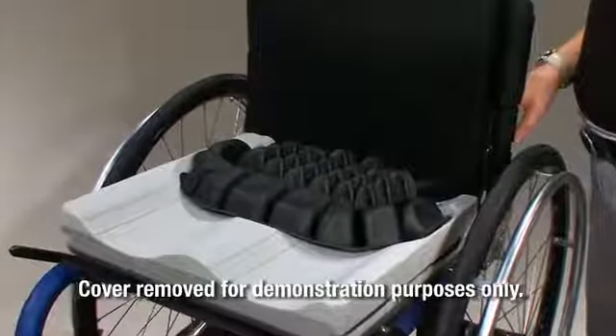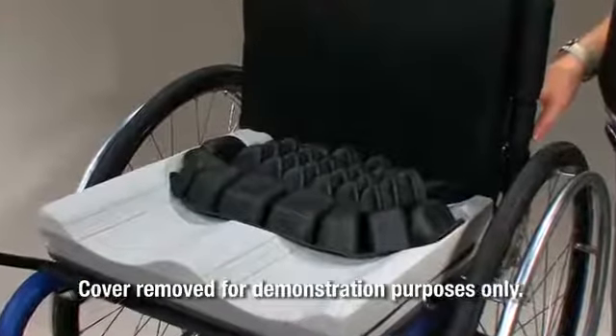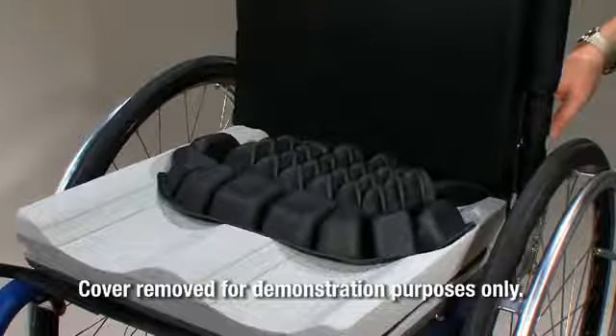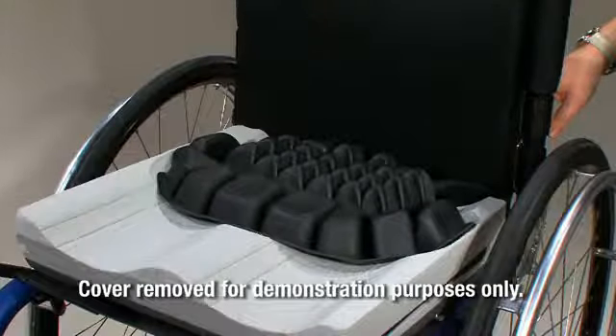The Hybrid Elite is a wheelchair support surface with a Roho Dry Flotation Air-Filled Adjustable Cellular Design Insert combined with a contoured foam base designed to conform to a user's seated shape in the pelvic loading area.